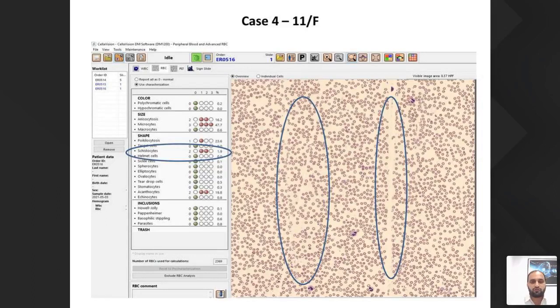So this was not actually the disease process going on. This was something which I had put in, some garbage that I had put in, and what I was getting out was garbage. So a not well prepared slide might mislead you.